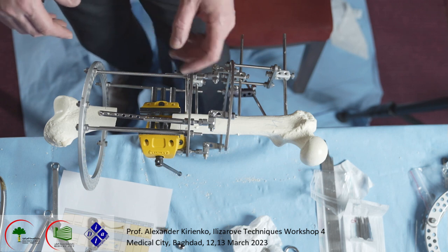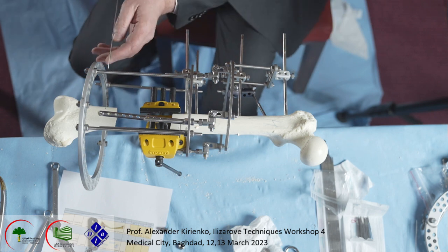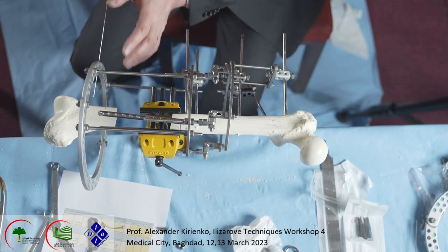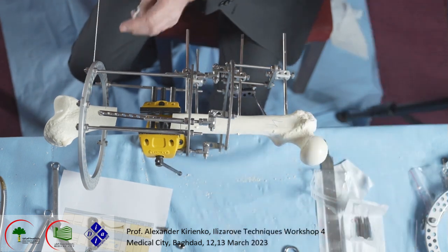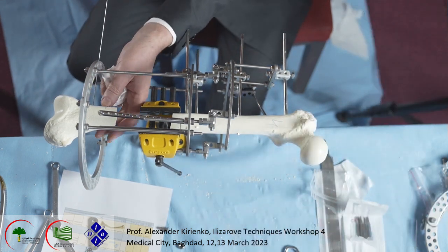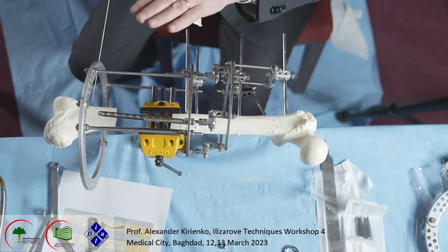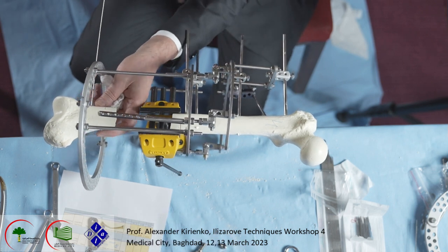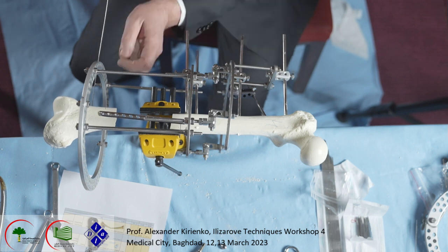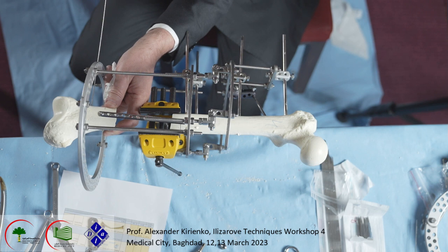This first wire, when you put it in this position perpendicular to the distal femur, if it is going exactly in this frontal plane, there is less displacement of the soft tissue and less impingement of the knee motion during the treatment.